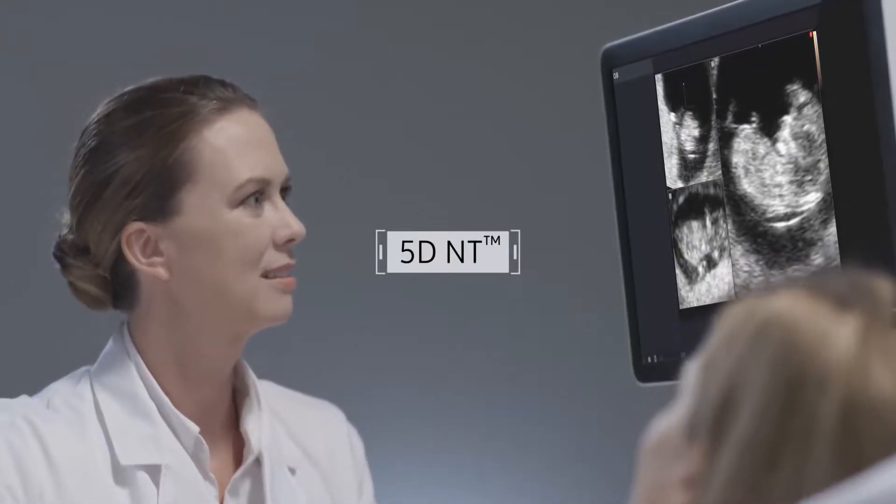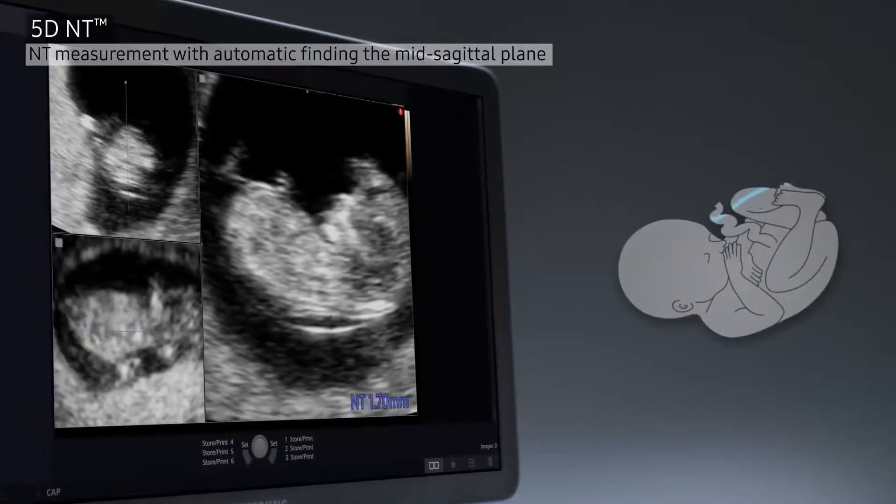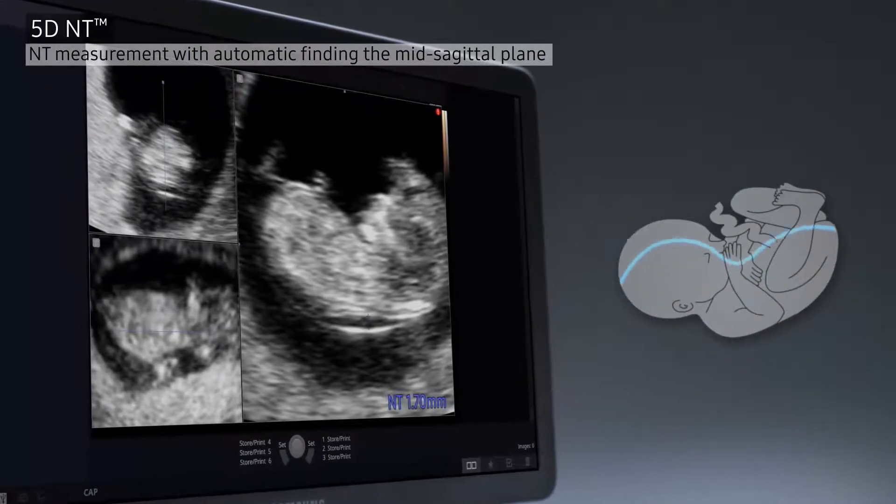A novel technology, 5D NT automatically finds the midsagittal plane from an acquired volumetric data and measures the maximum NT distance.